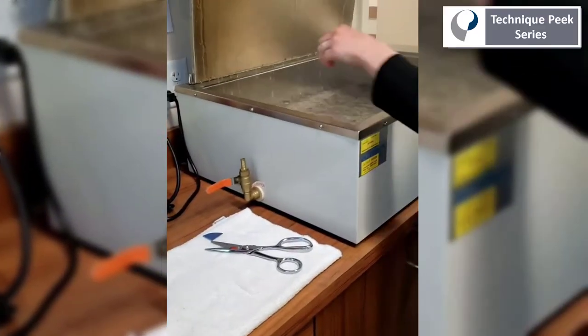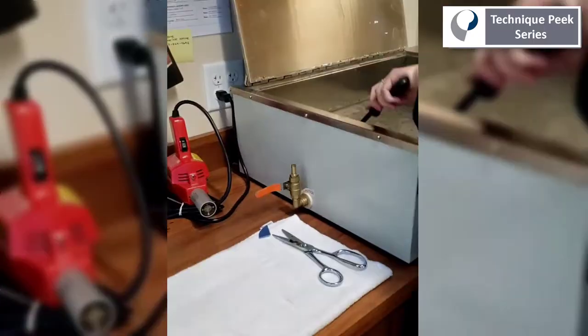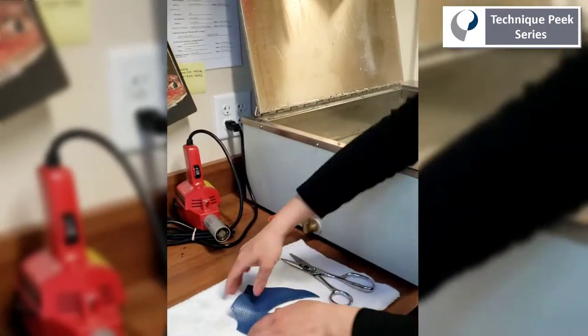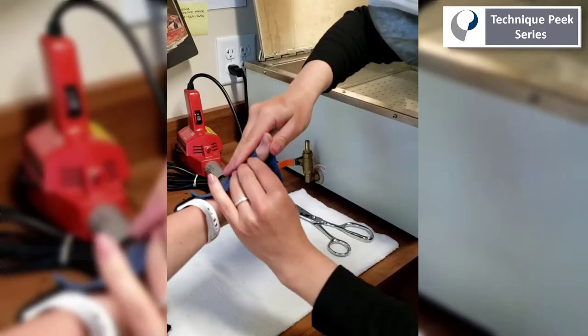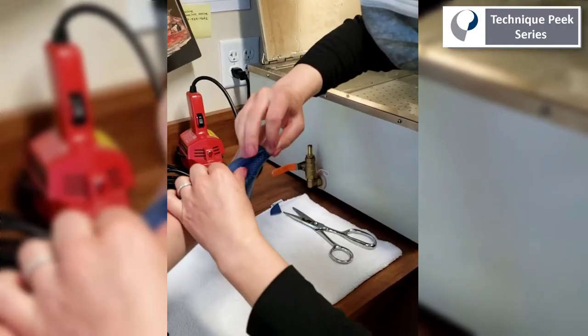We'll place the material in the warm water to soften. When we mold the material onto the patient, we're going to place the cut side in the web space of the thumb, wrap the open edge around the IP joint of the thumb down to the CMC joint, and seal the edge.